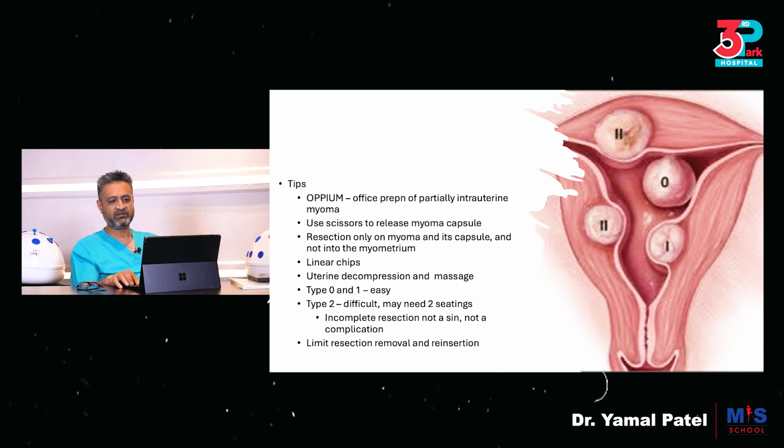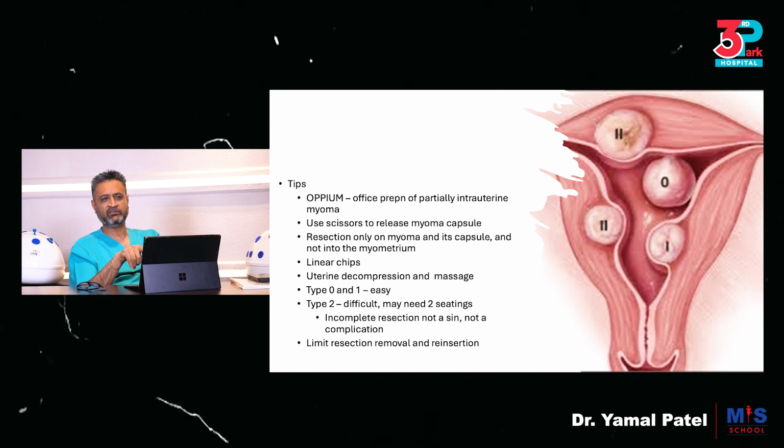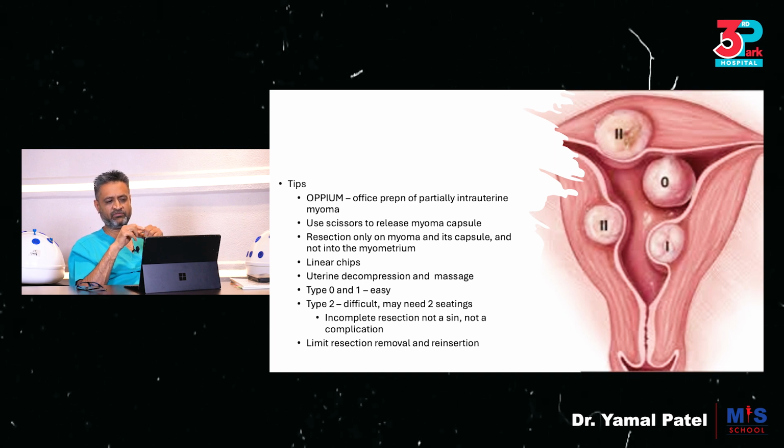Limit resection, removal, and reinsertion of the hysteroscope all the time. So make sure that you don't have too many in and out of the hysteroscope. Your risks increase exponentially when you do repeated reinsertions and removal, including risks of embolism.